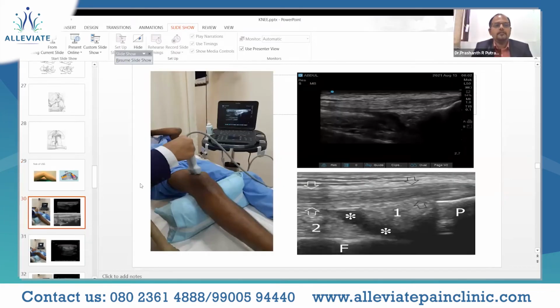While performing the scan, especially the ultrasound scan, ergonomics is very important, which means where the performer of the scan is sitting and at what angle they are visualizing the screen is also very important.